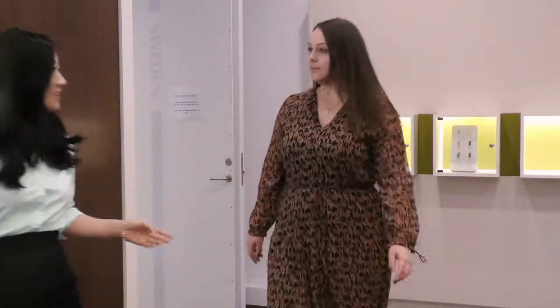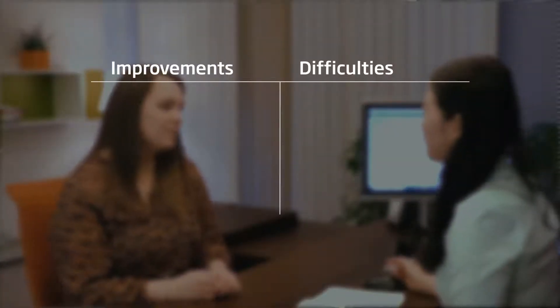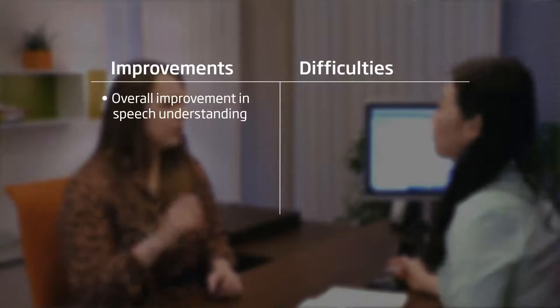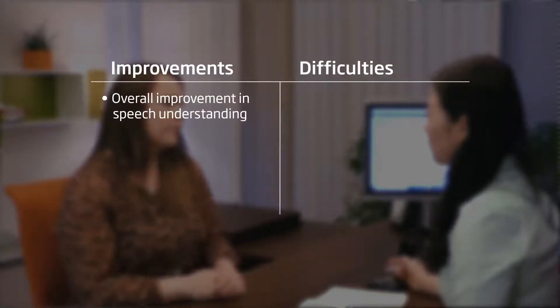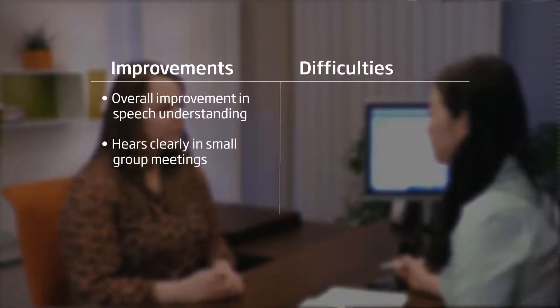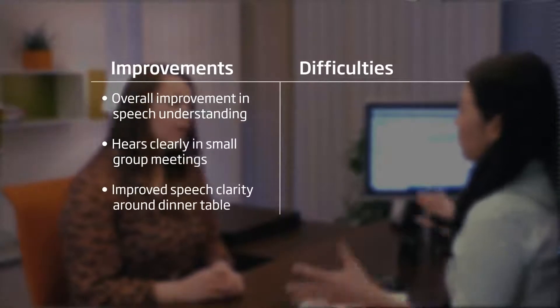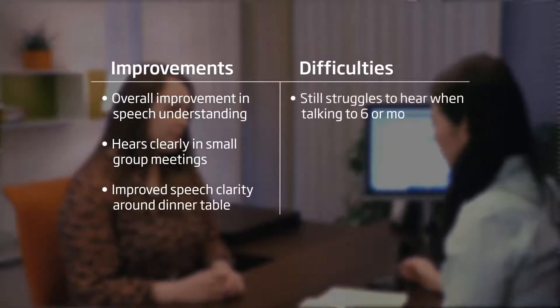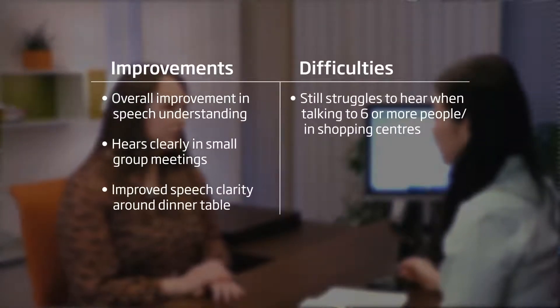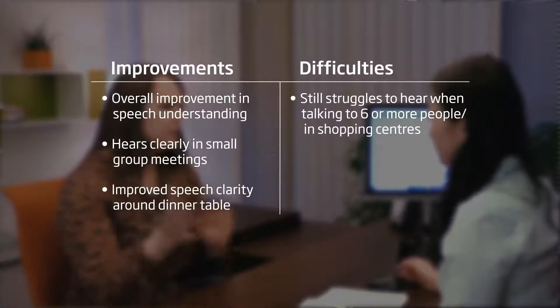Rachel has returned to the clinic a week after the fitting after trying out Oticon More 1 in her own environment. Rachel is generally very happy with the results from using Oticon More. She reports a big improvement in speech understanding in meeting rooms of small groups of people and also around the dinner table with the family where the noise level is fairly low. But Rachel still struggles to hear in larger meeting rooms where there are more people talking at once.